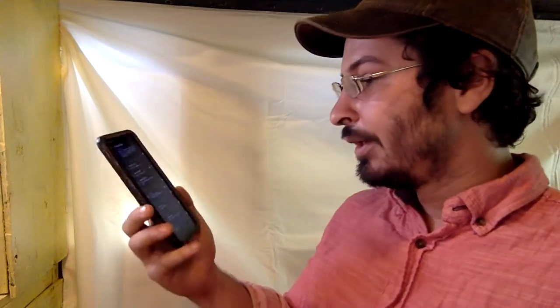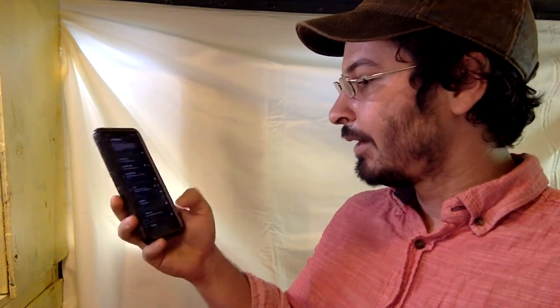So if the maximum basal rate that I get at any point of the day is, let's say, 1, so the math's easy, 1 unit per hour, then the maximum IOB setting for me will be 3, meaning the system can automatically increase my basal up to 3 units per hour as a maximum. But if you're using SMB, it can do that with the basal, but it can also add a bolus. So those numbers are much higher.